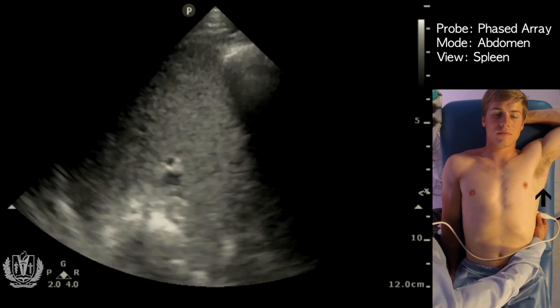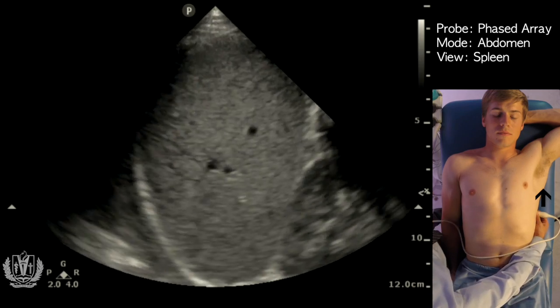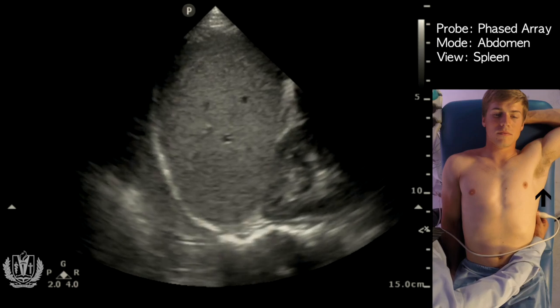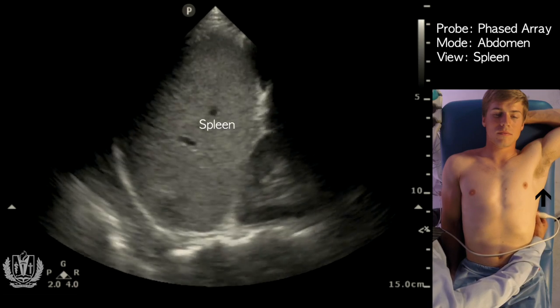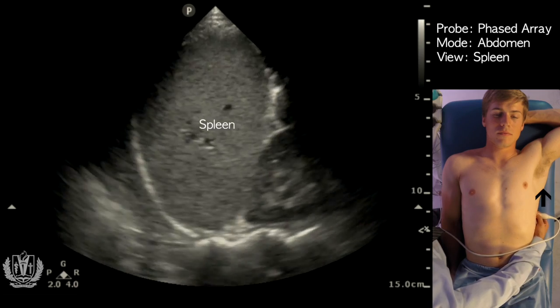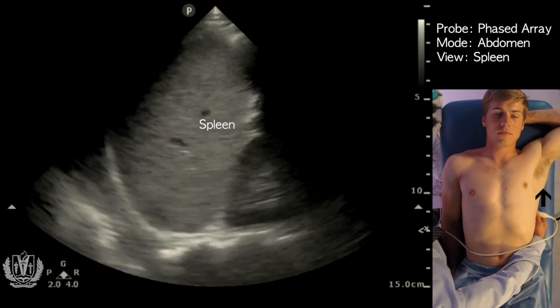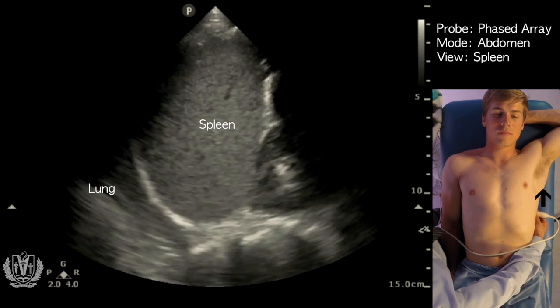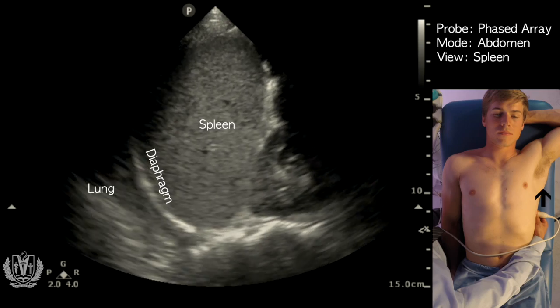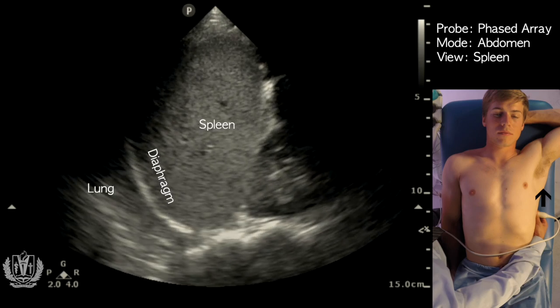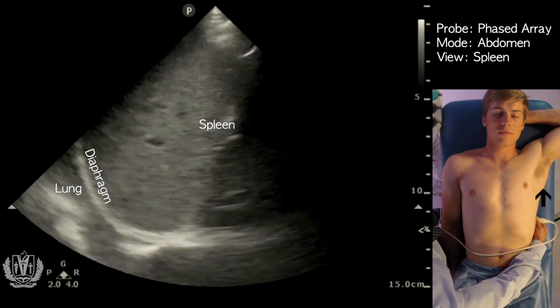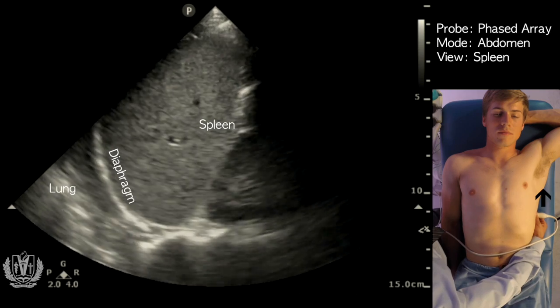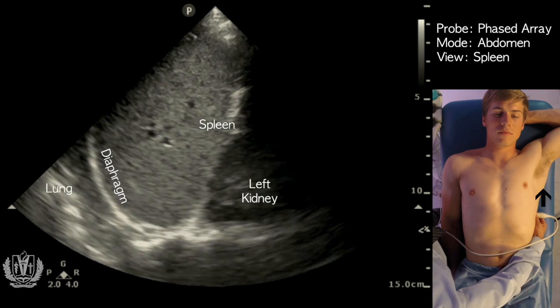Here we're going to place the probe on the patient. You can see the spleen in the middle of the screen. From superior to inferior, you see the lung, the hyperechoic diaphragm, the spleen, and as we move more inferiorly, we see portions of the left kidney as well.